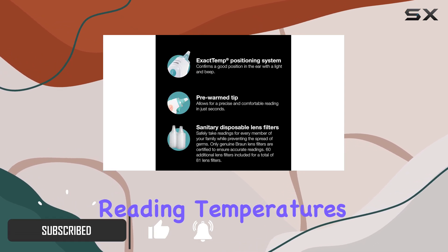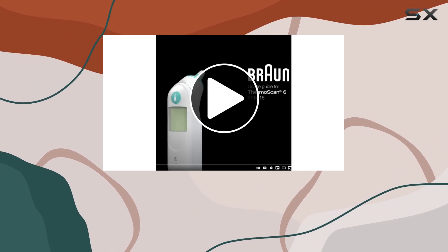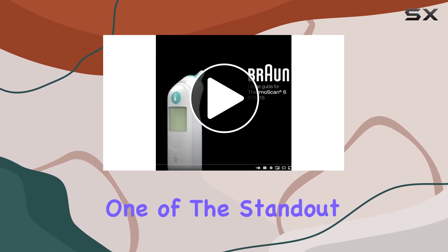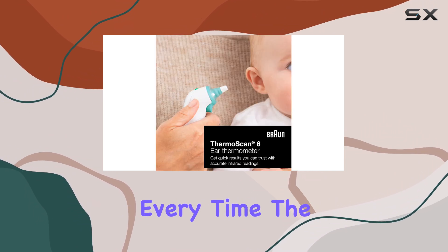The digital display makes reading temperatures a breeze, and the color-coded system ensures you can quickly identify any potential issues. One of the standout features is the pre-warm tip, which ensures accurate readings every time.